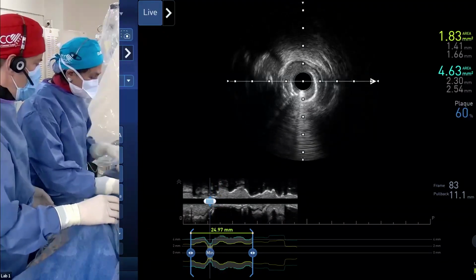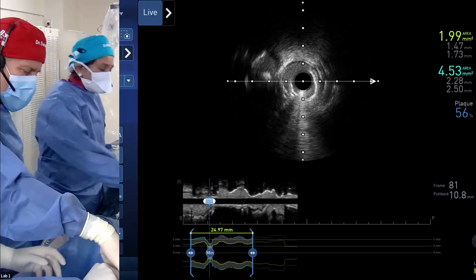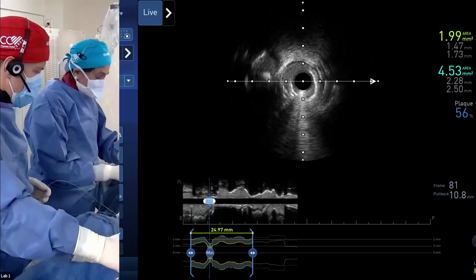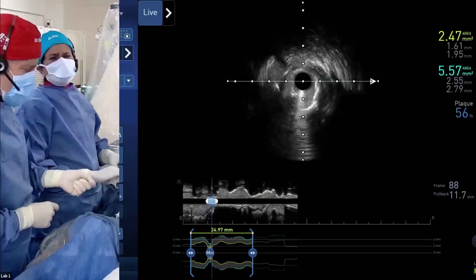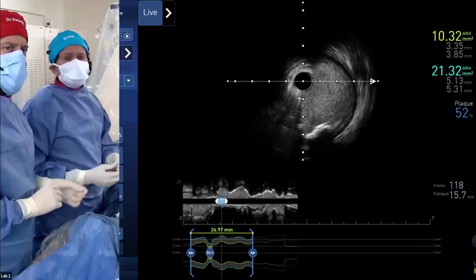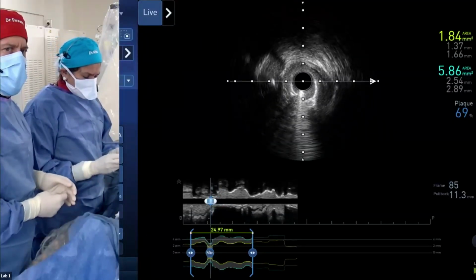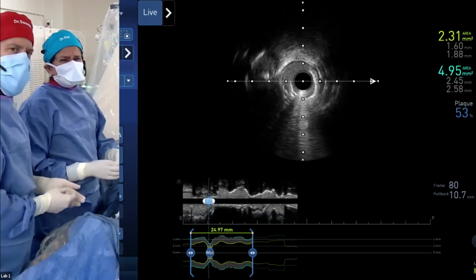So it's at the level of the diag, like a 270 calcium. Louder, I can't hear. I see, you broke the calcium on the LAD. Yeah, this is at the level of the diag. So you see, you broke the diag wall also. Look at the 11 o'clock. That's a bad tear that goes towards the adventitia, right near the calcium.